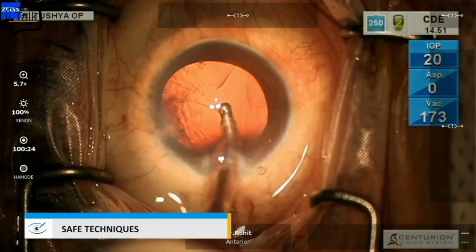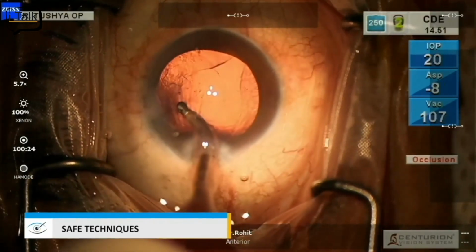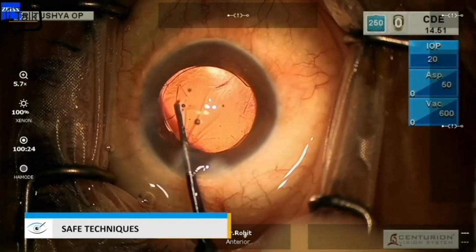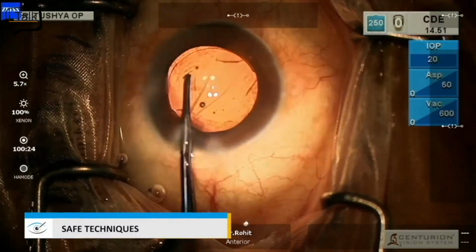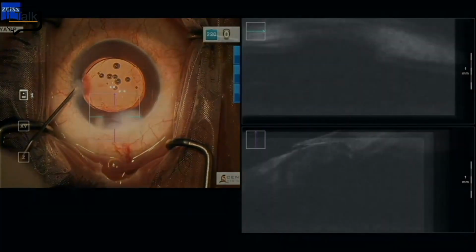Another important thing, you should always have stable chamber settings. While bringing out the phaco handpiece, you see the way I am injecting so that there are stable chamber settings. Now I am enlarging the rhexis, but there's one mistake. And what is that mistake? The alignment of the IOL should have been at 90 degrees to the anterior capsular tear flaps. So these are the tips.